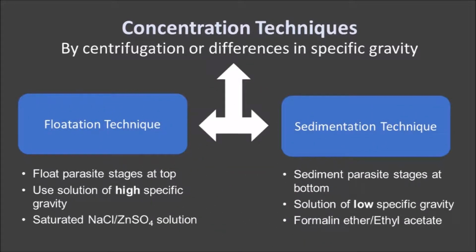There are two concentration techniques. One is the flotation technique. Here, we separate cysts and eggs from the bulk of the fecal matter by floating parasite stages on the top, using a solution of high specific gravity like saturated sodium chloride or zinc sulfate.